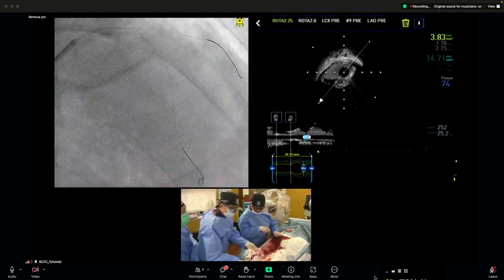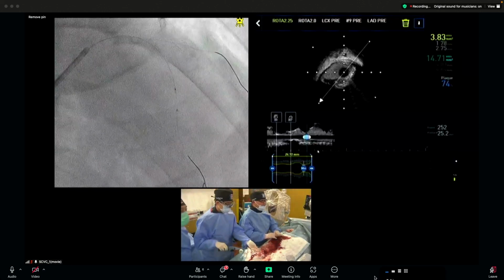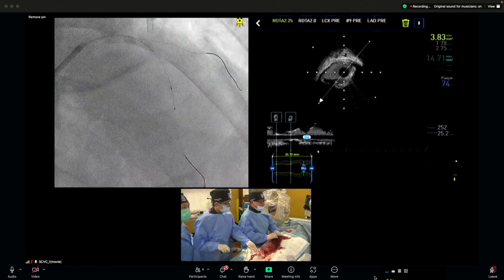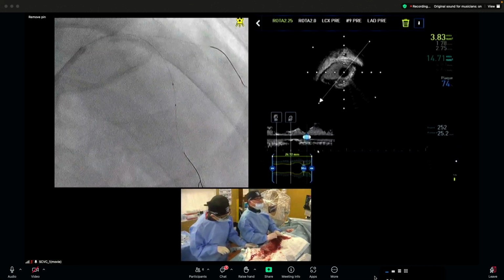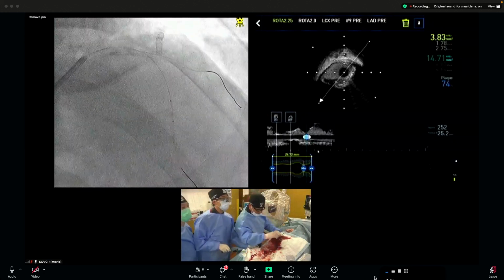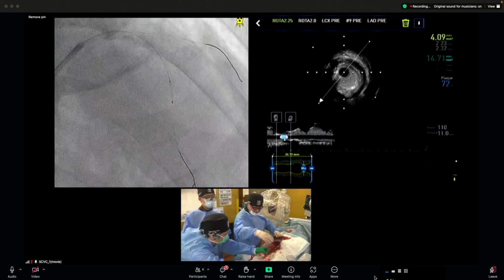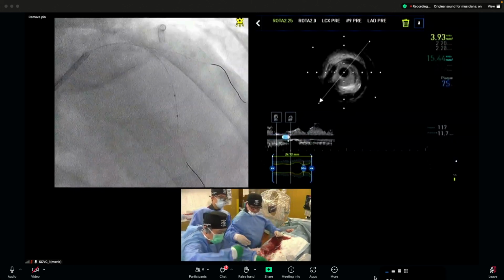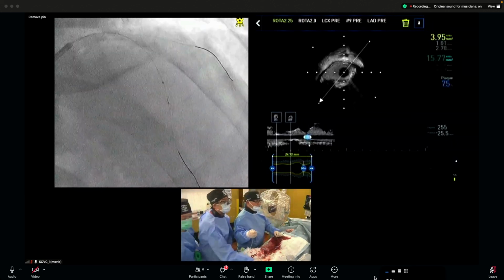Maybe I have a question to Dr. Kishima or to the panel. As a follow-up question, for those really severely calcified bifurcation lesions that have a high risk of side branch occlusion, we can perform sequential rotablation. We need to pull out the guide wire in the side branch, otherwise we cut the guide wire.